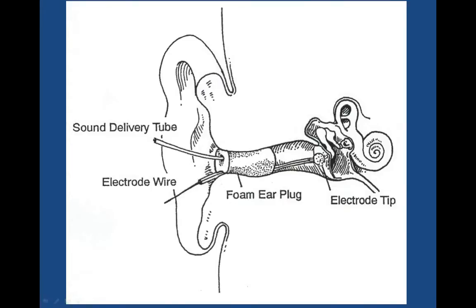Recognize the fact that it's going to be high, but also recognize the fact that the electrode being more near-field in nature to the response generators in the cochlea will produce a signal that really is considerably higher than the noise floor, even in the face of a high impedance.